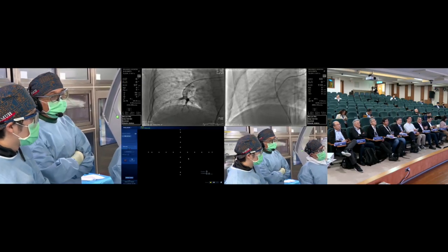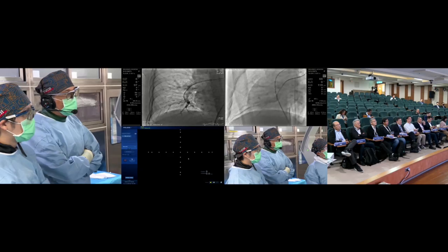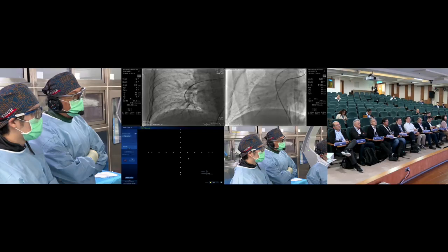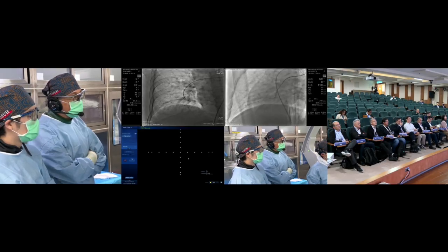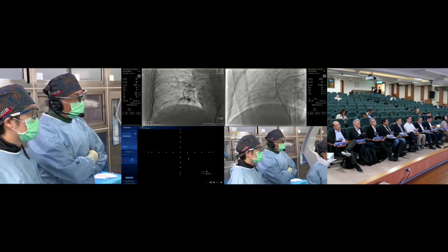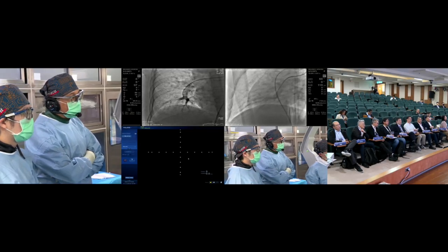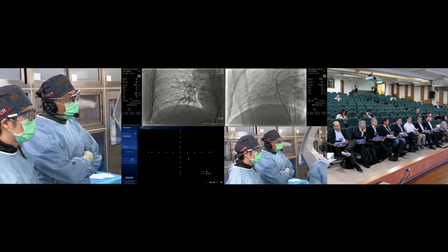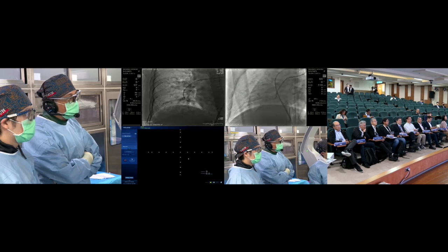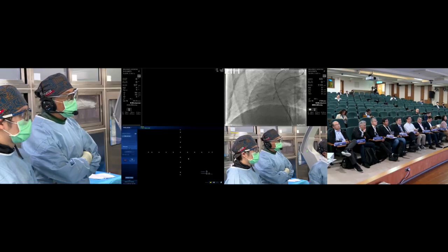According to Dr. Zheng's mini lecture, we are also following the rule. We are targeting the right lower lung first, because it's the most beneficial zone to target. If we can get a good venous return, I think there should be some good effect on the pulmonary arterial pressure, because currently the pressure is still very high. So for the first one or two sessions, our main goal is to lower the mean pulmonary pressure a little bit. And then we can target more lesions in the future.